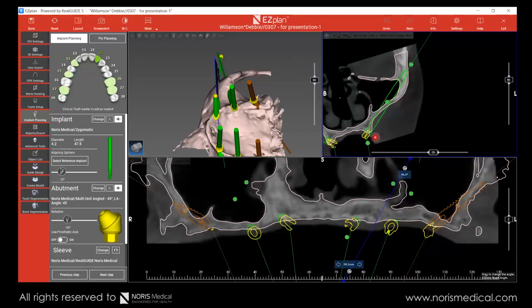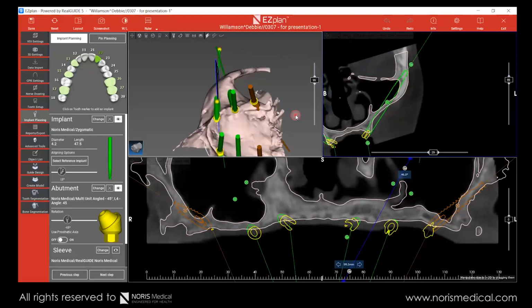Usually, if we have that, the zygoma doesn't work for itself. It's part of a construction, and we have to look at it as a construction. So when we have all the multi-units combined together on a fixed bridge, then basically we have a construction, and this position doesn't work as a moment. It works differently, and it works. Okay, so we have to take this into account as well. Okay, so this is the anterior implant. Let's look at the posterior implant.